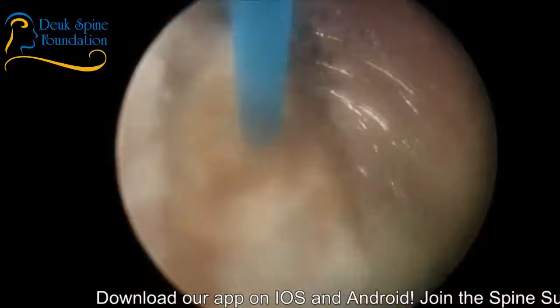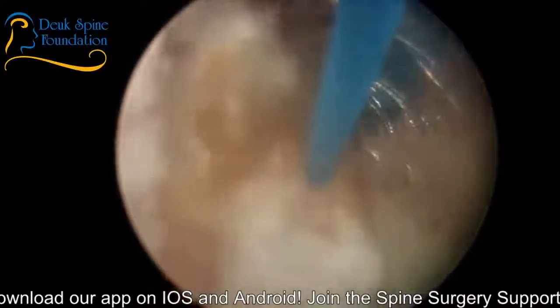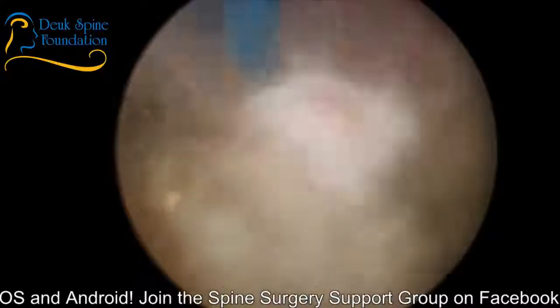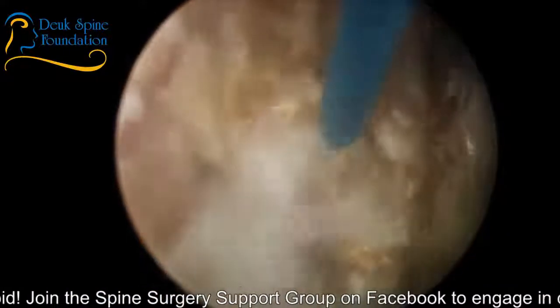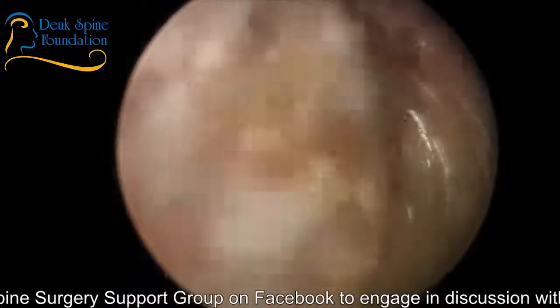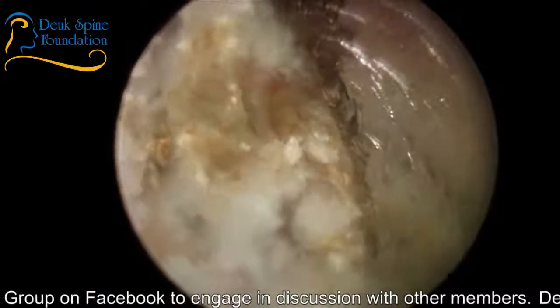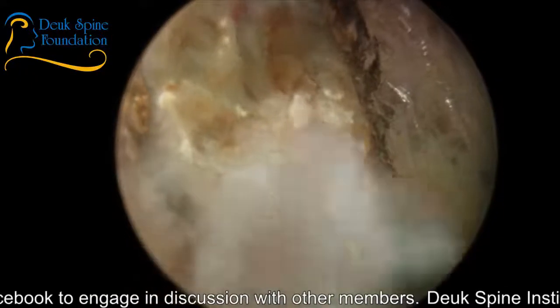The point is that I know I can work around the bleeding, even though it would be very difficult. If this was my first case ever doing this, it would be very concerning and I probably wouldn't do as good of a job. But since I've had this problem before, I know how to deal with it. And I'll show you some of the tricks as we go along for dealing with the bleeding. But the most important, standby laser, is to try to avoid it. So don't injure the bone.